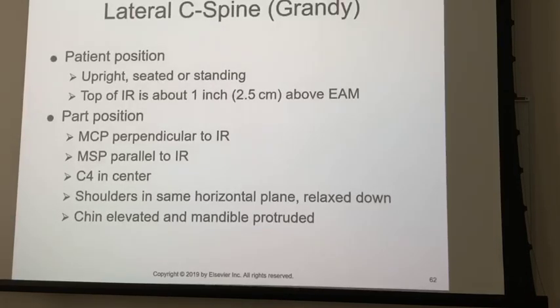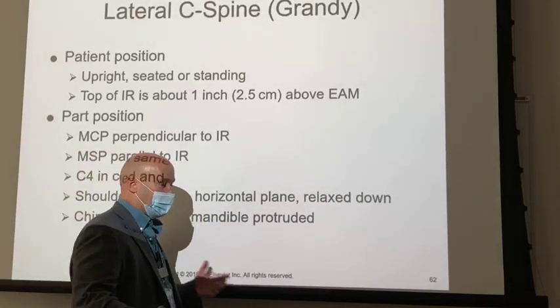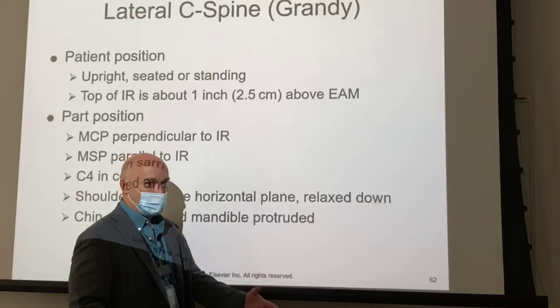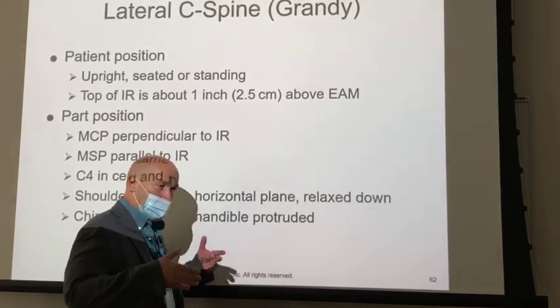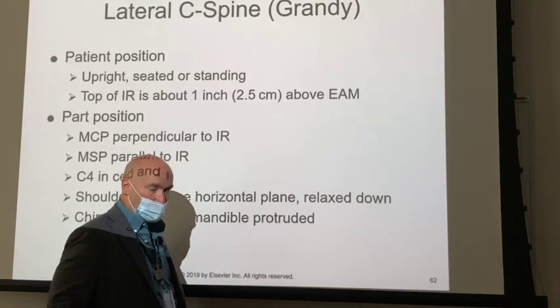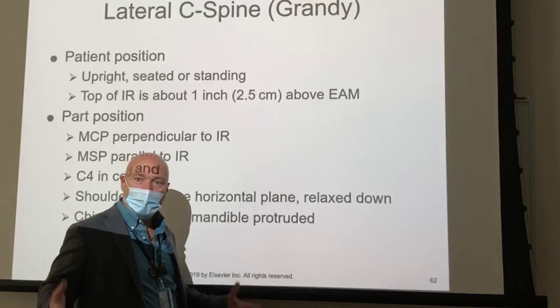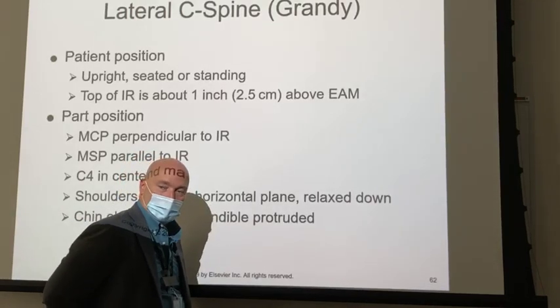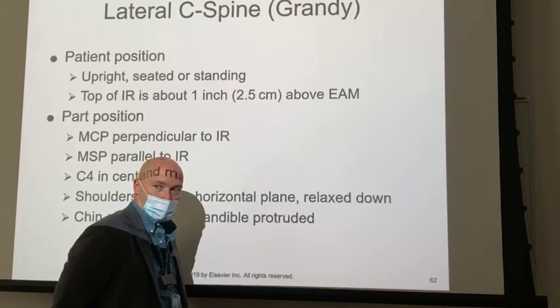It's very important to have the patient in the same horizontal plane. If you tell the patient, just like in a chest x-ray, put your side up against there, they're going to have a tendency to lean into it, okay? So have them put their feet straight up under them, have them stand up straight. Put their arms and their hands behind their back. Okay, tell them to join their fingers together behind their back. And before you make your exposure, you're going to have them straighten their elbows.